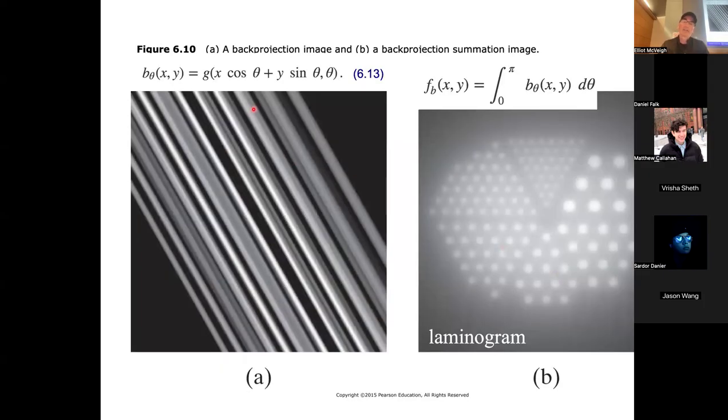And when you do this naive back projection, all we're going to do is back project those G(L, theta) values. Remember, L is all the x,y points that satisfy this thing being equal to L, and theta. So I'm just going to plop that value down on the plane. For a specific L, it's all the same value, and they're all oriented at theta.